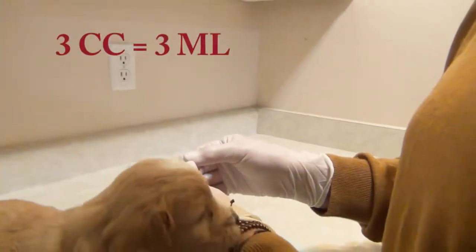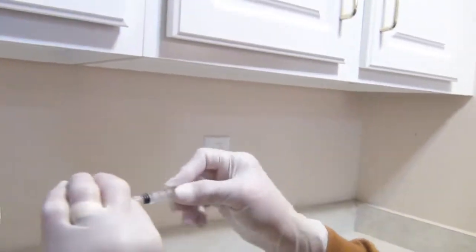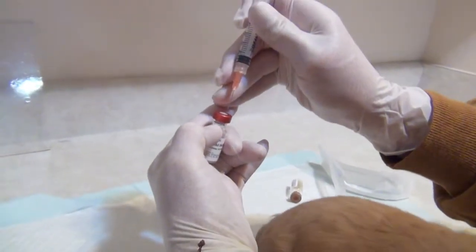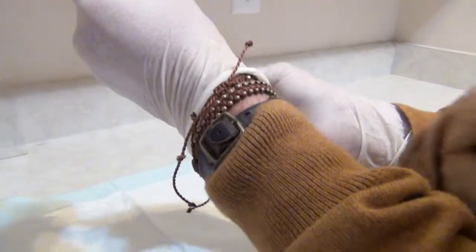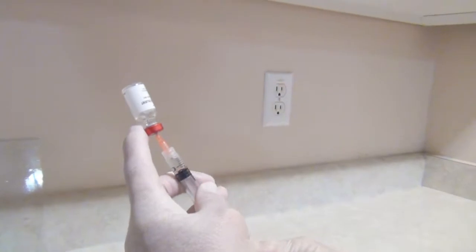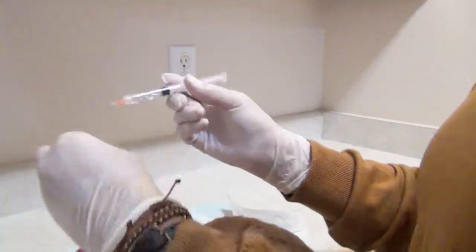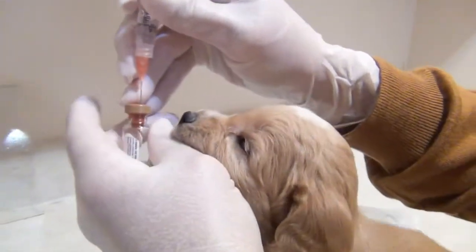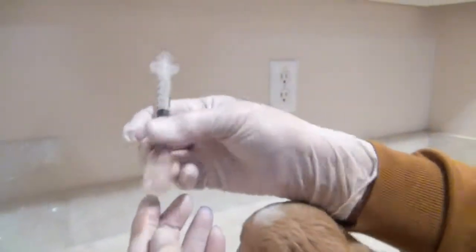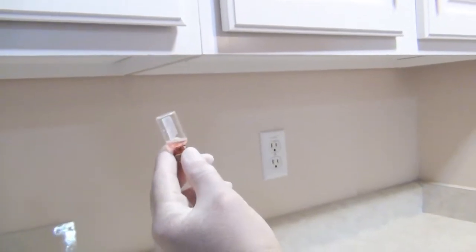The syringe is three cc's or three milliliters — same thing. Make sure you've twisted the cap on tight, then pull it and just be careful where you're putting the needle. It's going to go in the center of the first tube. The first tube is the liquid that will be carrying the live virus. So we're reconstituting that live frozen virus — bring it all the way out — and then we're going to put that liquid into this live virus, which was powder and it's most often pink. I think that's just so that we know we've got the virus in the syringe.